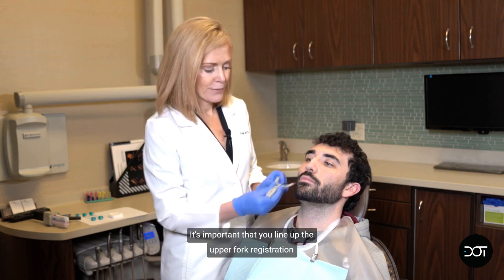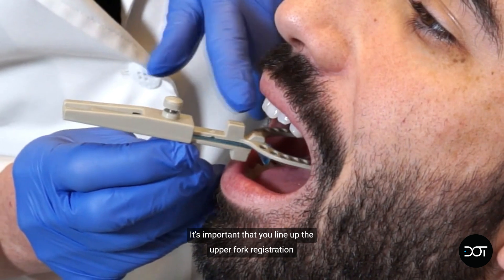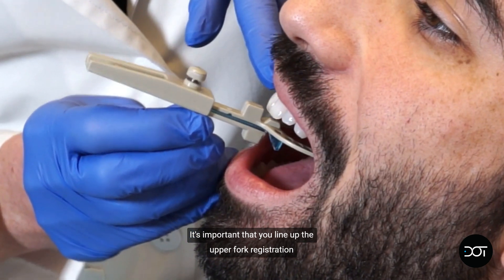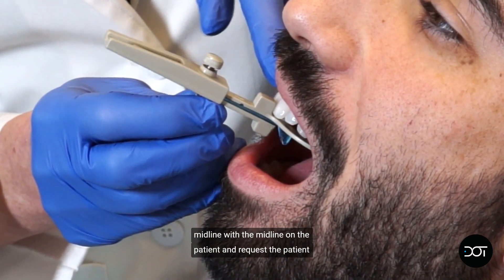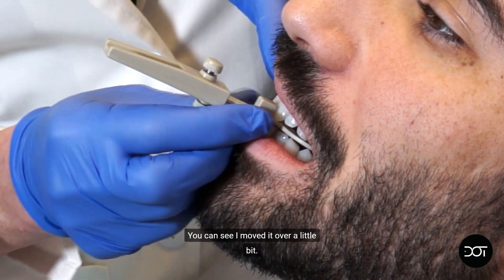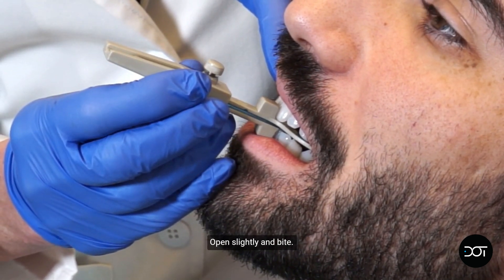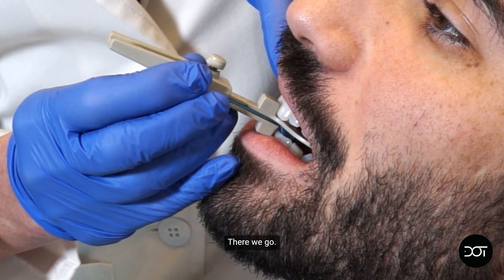Let's go ahead and try it in. It's important that you line up the upper fork registration midline with the midline on the patient and request the patient bite down. You can see I moved it over a little bit — let's make sure we get it lined up. Open slightly and bite.